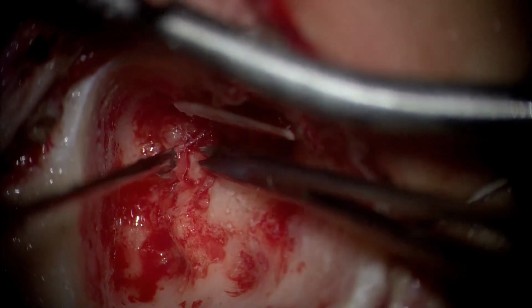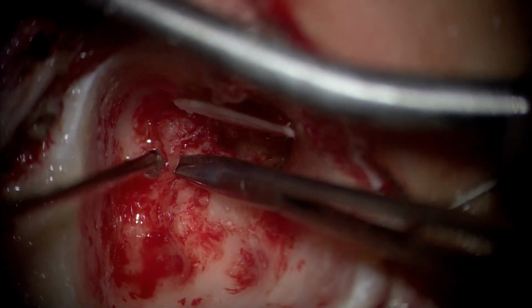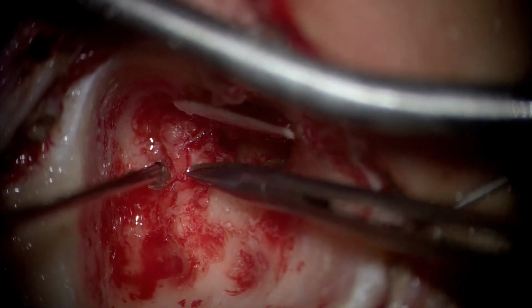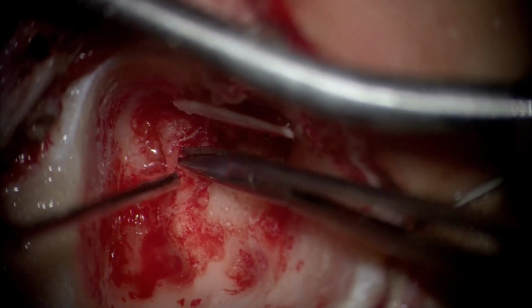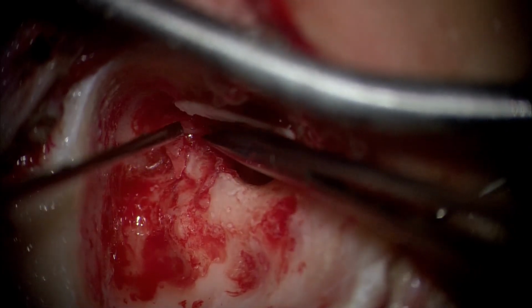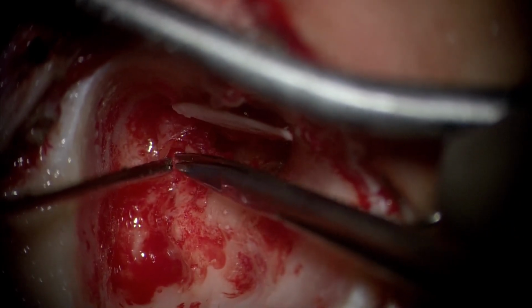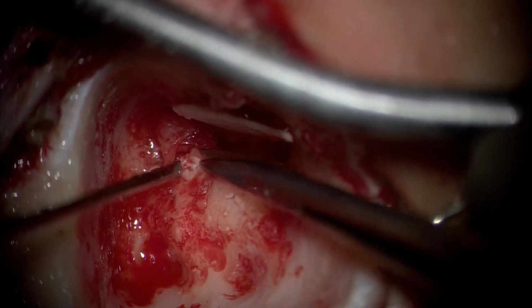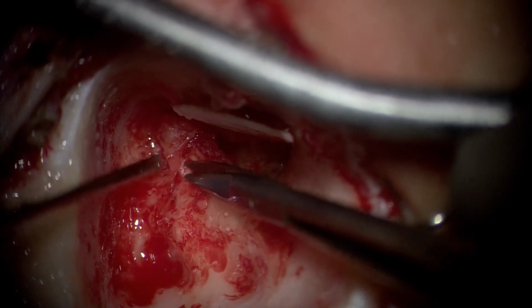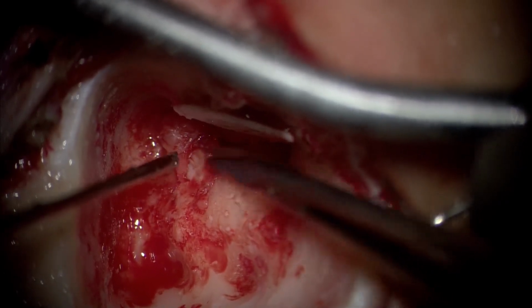So now what you'll see is we are seeing disease medial to the incus. We are dissecting the short process. Now, as of now, we don't know whether this is cholesteatoma or just a large bulbous dehiscent facial nerve, which could very well be there in this region, while one could see from the CT scan, but surgical visualization and confirmation remain paramount.